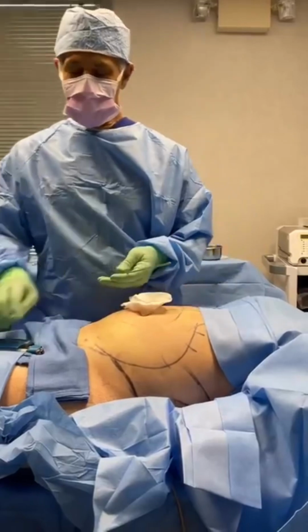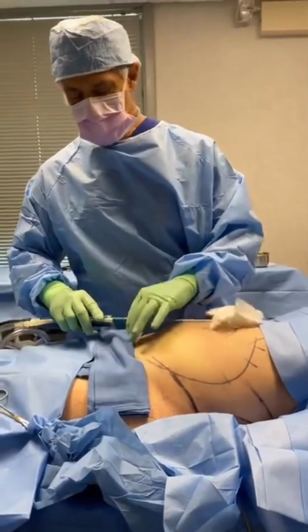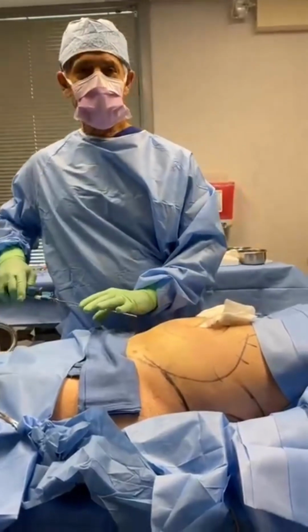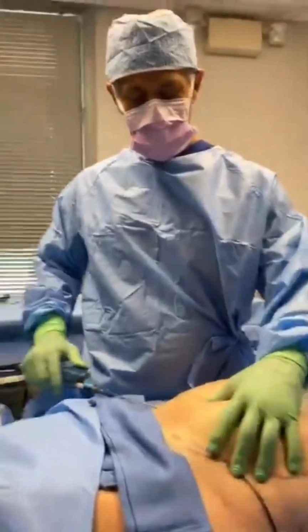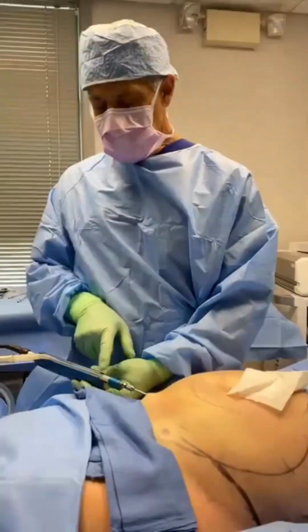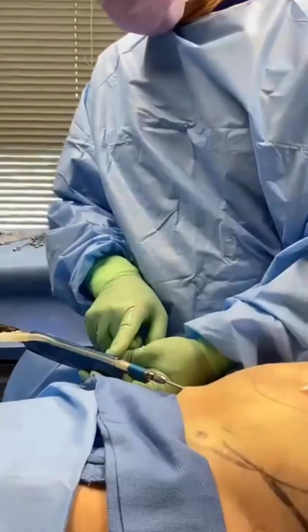We're going to get on with sucking out some fat. And actually, can you just fire up the suction for us? And are you still live? Yeah, okay, just fire up the suction and we'll show some fat coming out here. If you look right here on the tubing, and can you zoom in on that? So you're tight on that.